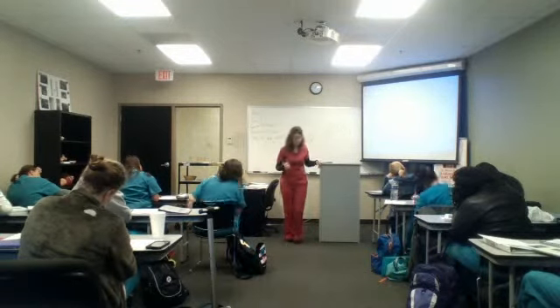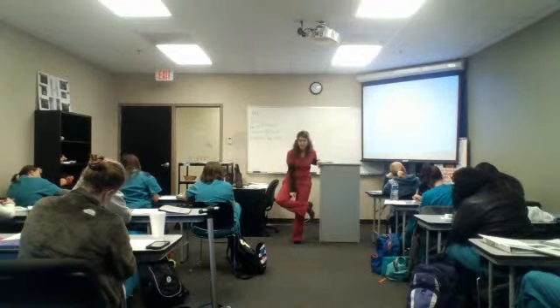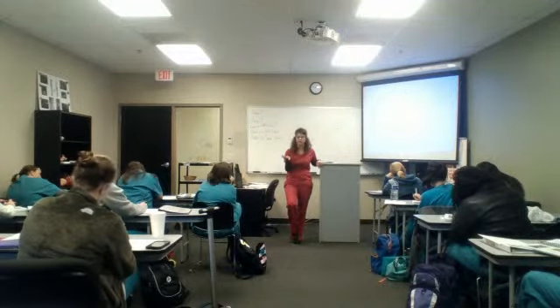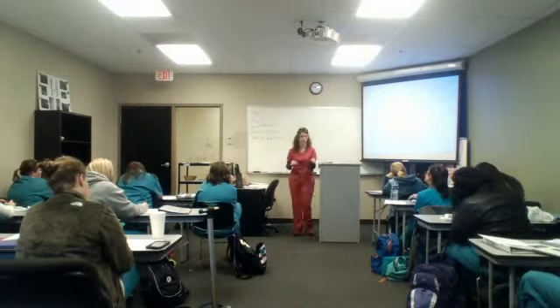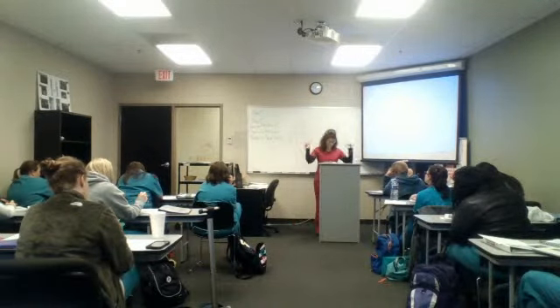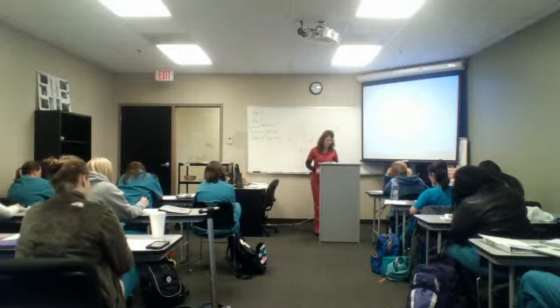So the greater saphenous vein runs the entire length of the leg. If I find a blood clot in the calf greater saphenous vein, no blood thinner. Even if I find it in the mid-thigh, no blood thinner. But if I find it very close to the common femoral vein, chances are they're going to put them on a blood thinner, okay? Everyone got that? Okay.